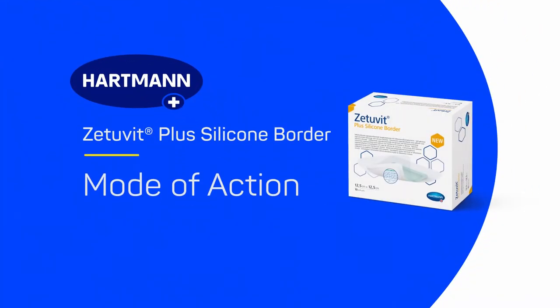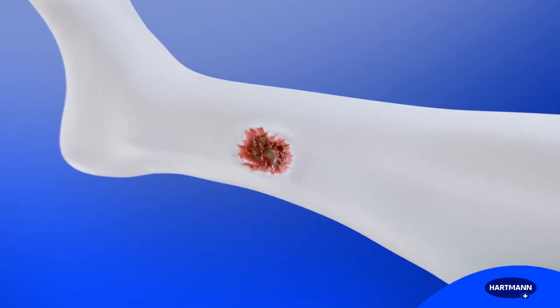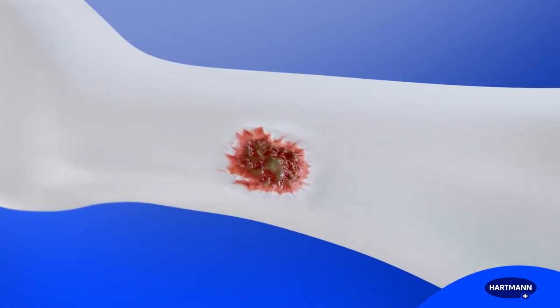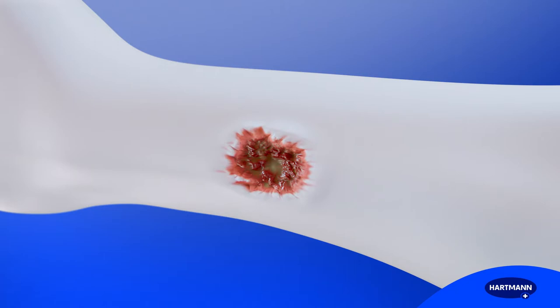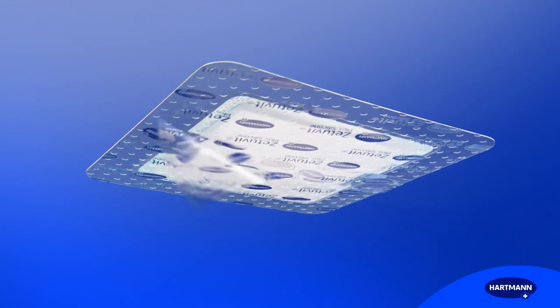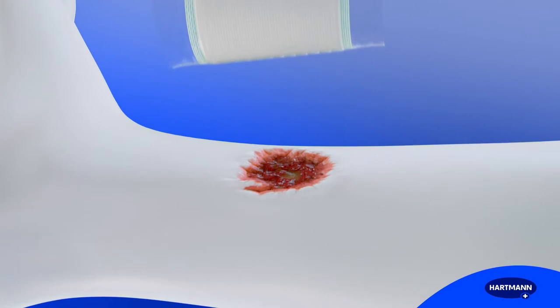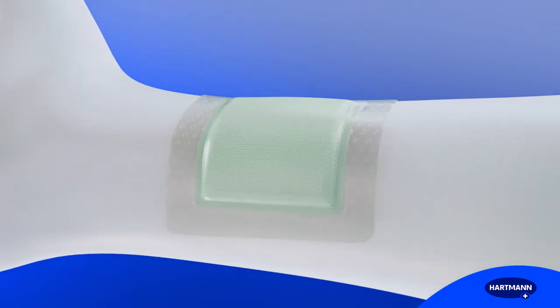Zetuvit Plus Silicone Border – Mode of action. Appropriate exudate management plays a key role in the healing of wounds with moderate to high exudate levels. Zetuvit Plus Silicone Border is a silicone SAP dressing with border that offers very high absorption and retention capacity while maintaining an optimal microclimate.